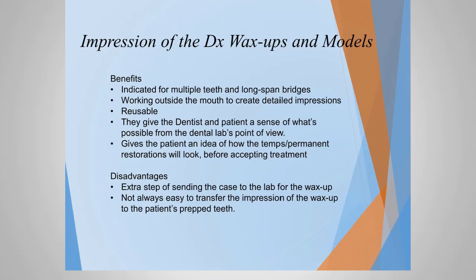So that's time away from this case. Also, it's not always easy, when we take an impression off these diagnostic wax-ups and off these models, to transfer that impression onto the patient's natural dentition when we're doing these cases.